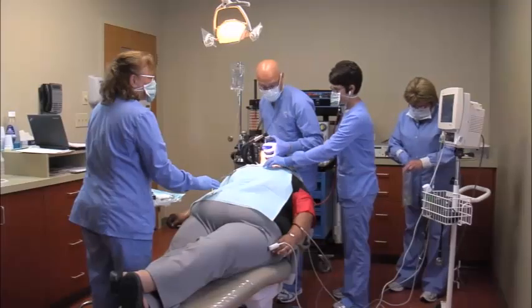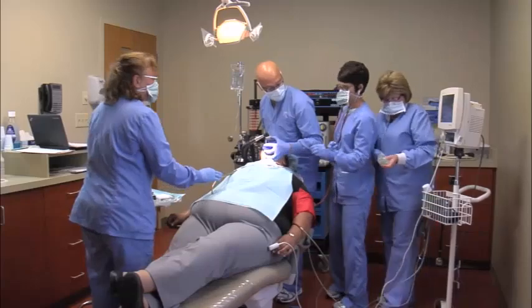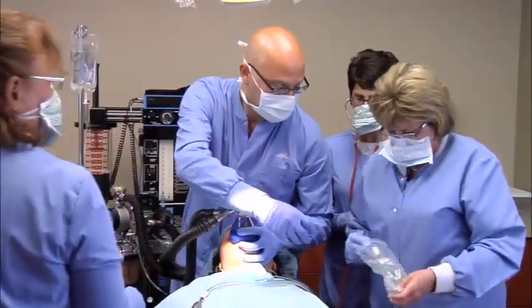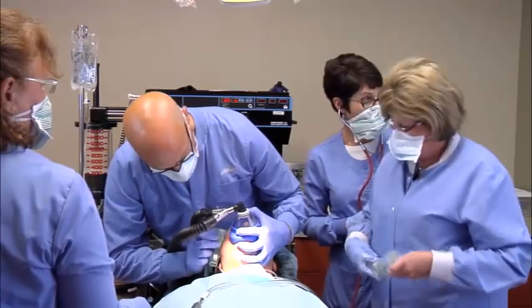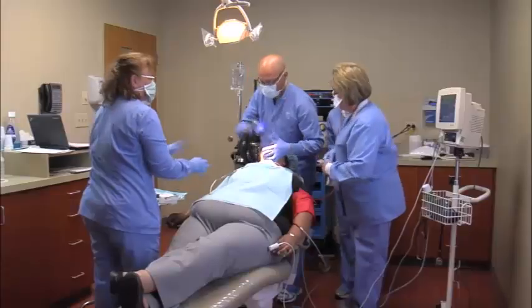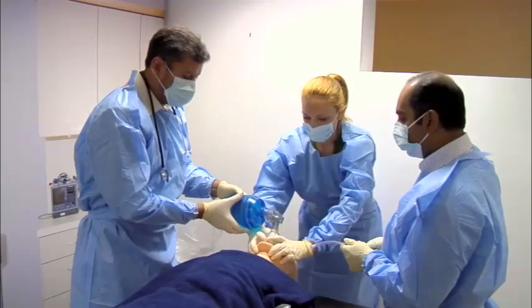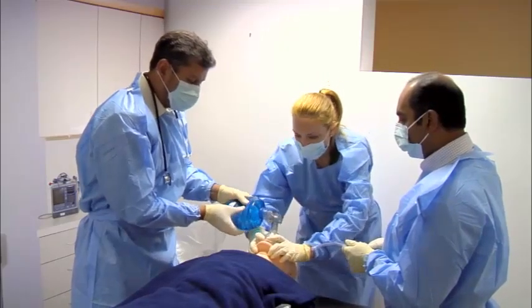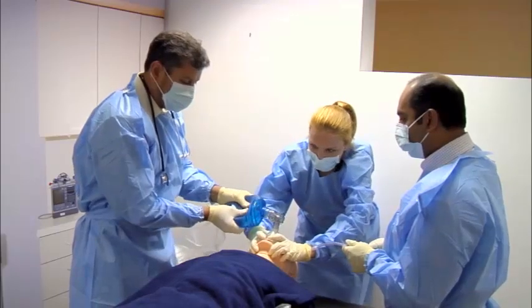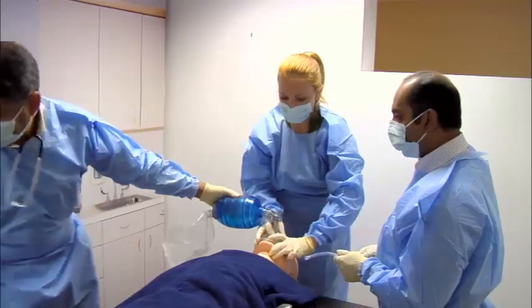If the patient becomes hypoxemic or fails to make respiratory effort, an oral pharyngeal or nasopharyngeal airway should be used in conjunction with bag mask ventilation. The attempt to ventilate the patient with these devices fails. An attempt is made at this point to establish an airway by insertion of a laryngeal mask airway, or LMA. Chest rise, I don't think we're adequately ventilating this patient. That's placed a supraglottic airway. Would you give me an LMA, please?